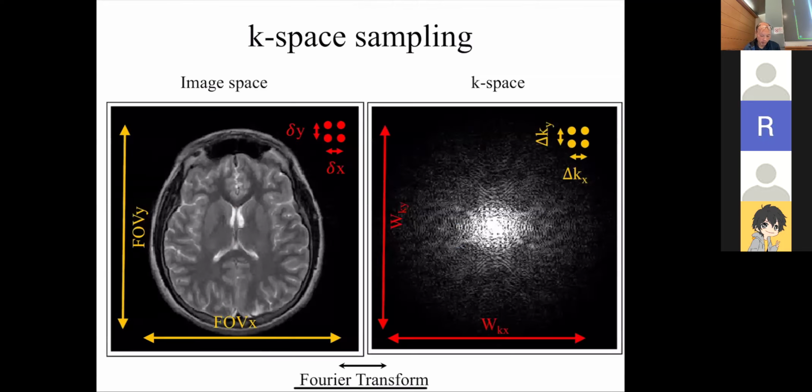So let me see where we're at. Okay, so we're going to start on how we actually apply this to an actual pulse sequence, and then we're going to finish that up next time. So remember, you're given these, or somehow you derive these input parameters, right? In the homeworks, I think you're just given these, right? And you need to figure out what these are first. And then the next thing we're going to talk about is how do we now translate that into the gradient design.